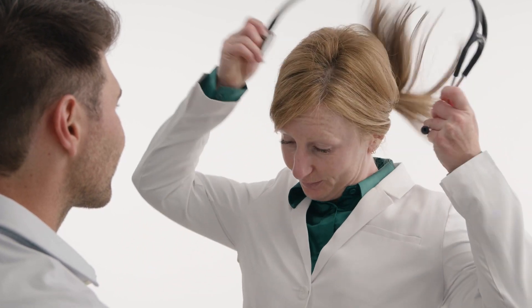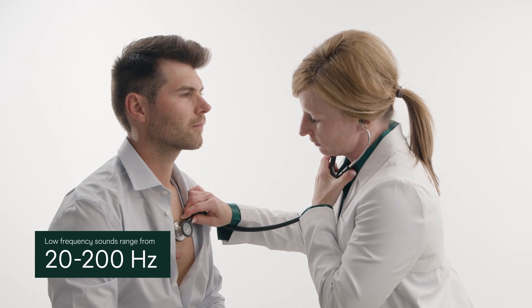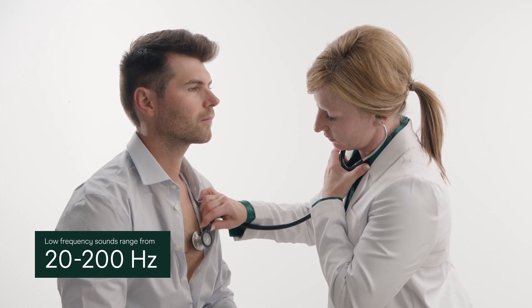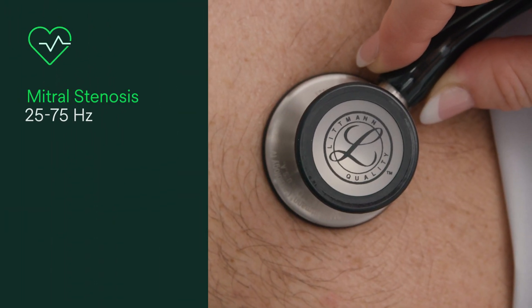Low frequency sounds range from 20 to 200 Hertz, typical of basic heart sounds and some cardiac murmurs. Heart sounds such as mitral stenosis, S3 and S4 gallops, and first and second heart sounds range from 20 to 150 Hertz.